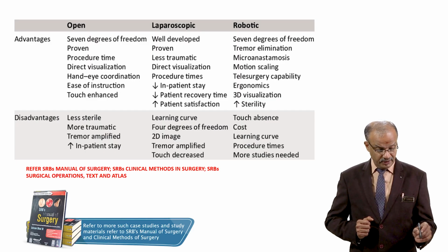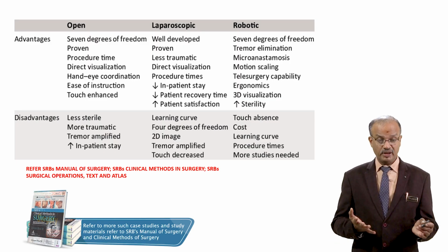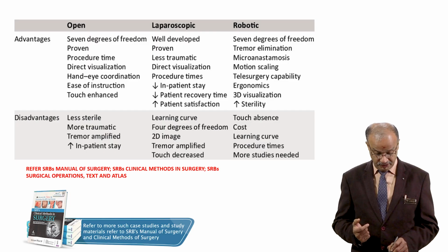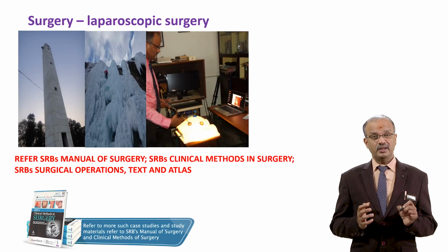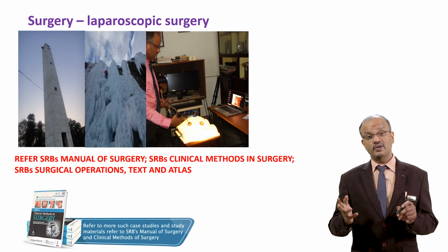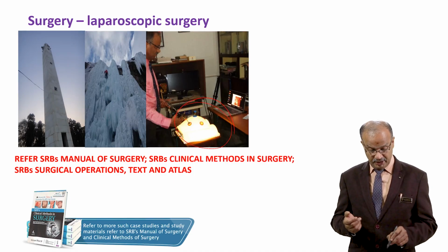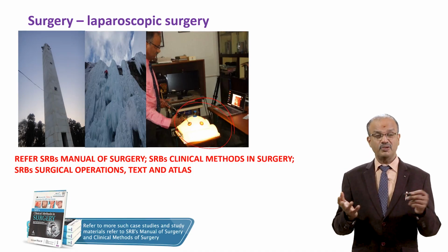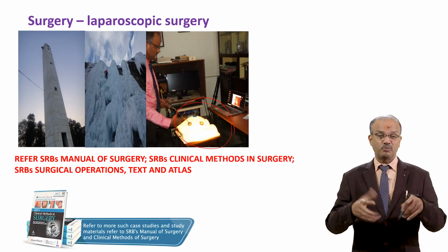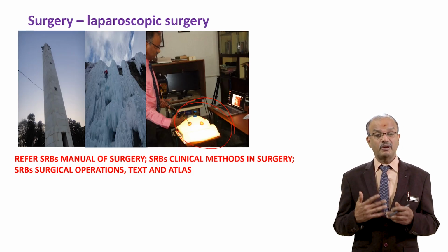So I'm not going to detail it. Open, laparoscopic, robotic: the advantages and disadvantages of these, hospital stay, cost factor, learning curve, everything is there. So surgery is a skilled one. Laparoscopic surgery is much more skilled. It's a long learning curve. Keep on doing, repeated learning, training. Endo trainer, keep on doing it. See, the surgeon, myself, daily you have to learn. Train with laparoscopy or hand movements to be skilled, especially suturing. So it's a continuous process to keep updated.